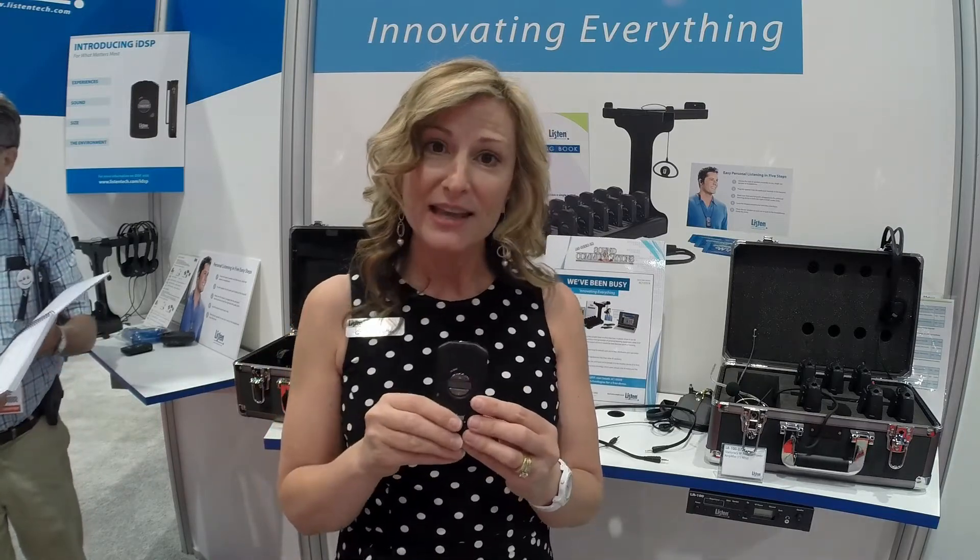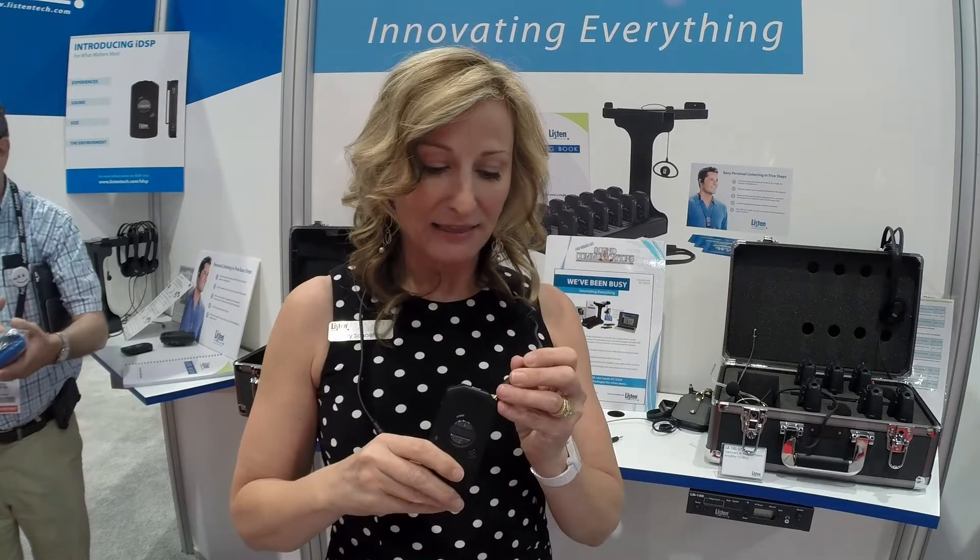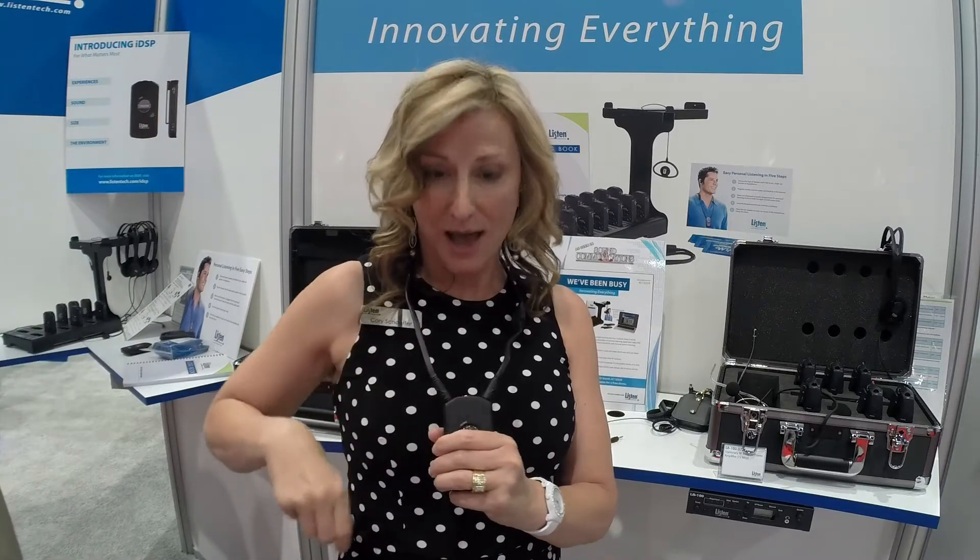To interface to users' hearing aids — many people don't know how that works. We've actually started with the hearing aid user in mind. We created a lanyard that allows users to wear it — I'm wearing a dress today, there's really no place for me to put a belt clip — so this lanyard allows me to wear it, and then it does a wireless magnetic field right up to a hearing aid or to a cochlear implant. And this is all I need.